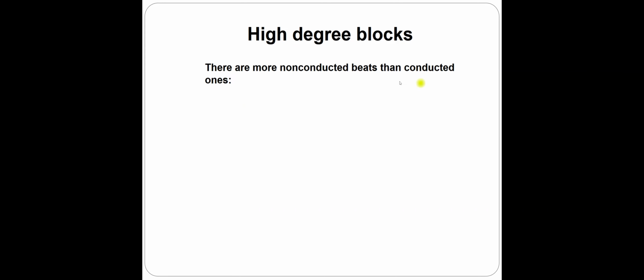All right? Can I now ask a question? Yes. Is it still second degree AV block? No, that's a high degree. This is why we said high degree, because in a second degree, by definition, we can have only one unconducted beat between two conducted ones. So that's a different entity. This is between the second degree and the third degree. That's what's called a high degree.